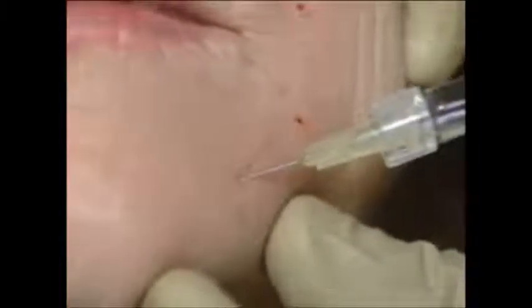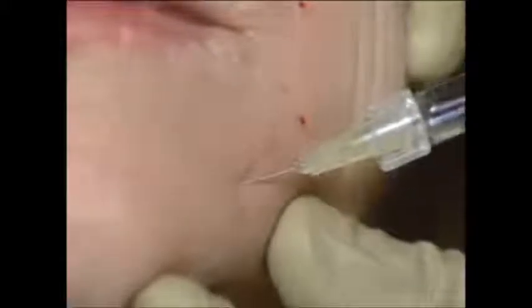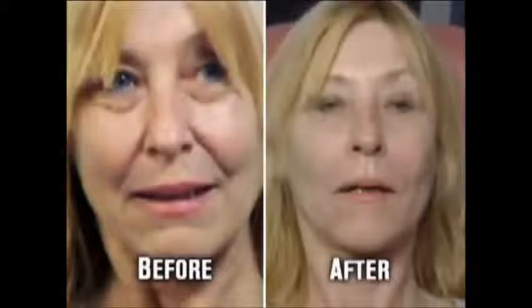Injections can also be performed in areas that are old acne scars and massage gently to smooth them out around the depth of the pit. When we look at the left and the right side, we can see the differences.